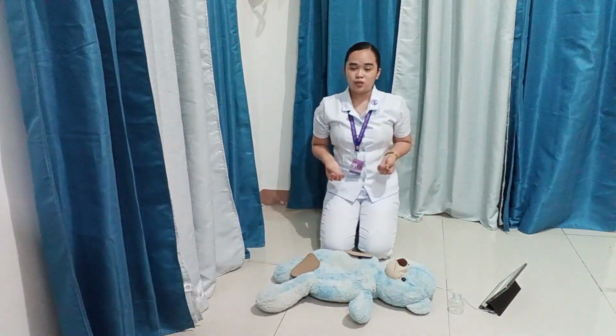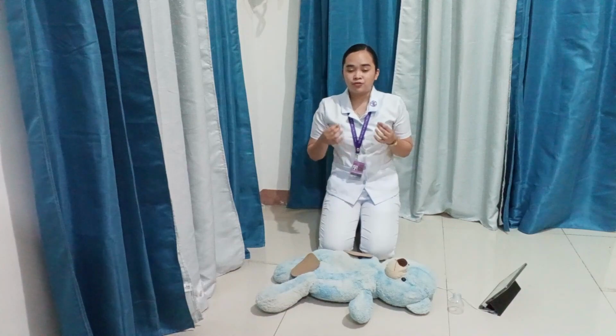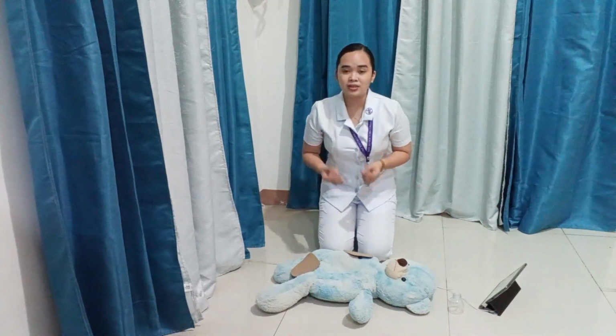So here, as you can see, we have safety, deliver a shock, and don't forget to switch roles every 2 minutes or every 5 cycles. And always remember to practice good team dynamics with your members here.